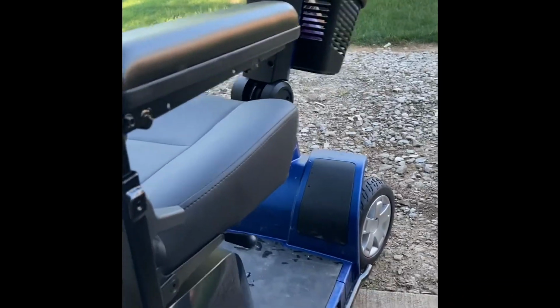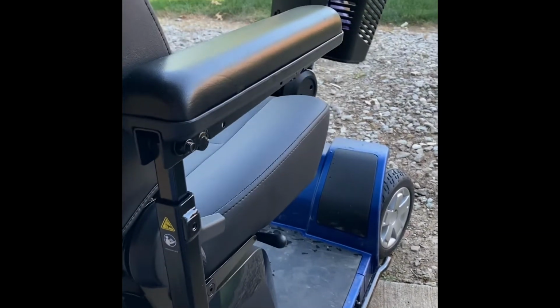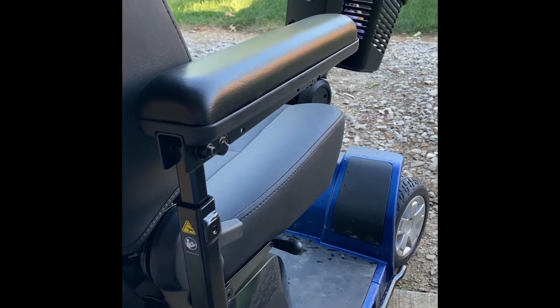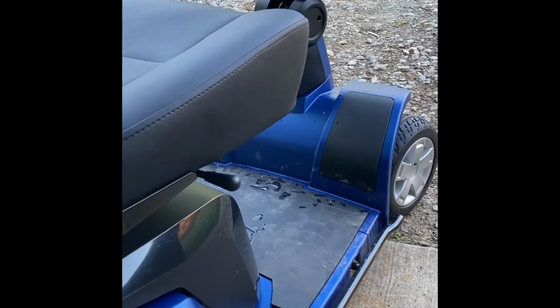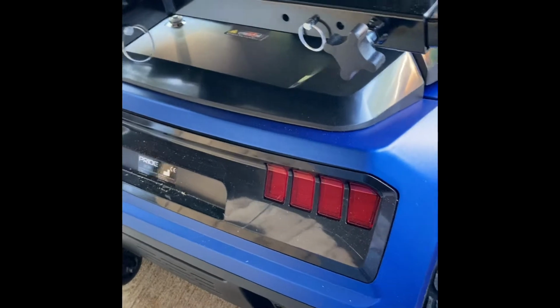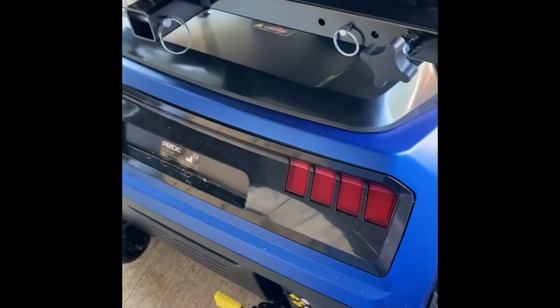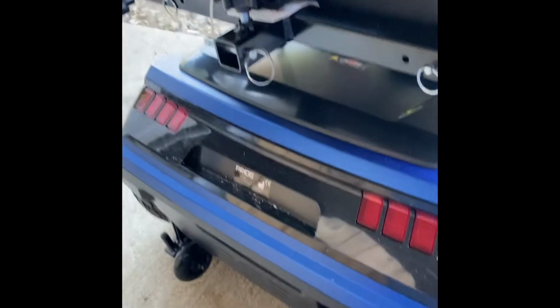Anyway, there's the scooter, Pride Mobility. It's got a lot of power. It goes well in the yard. I have to go slow in the yard because it doesn't really have much suspension in it. It's real stable. I can take that platform there and stand up on it and reach the bird feeder with no problem. I don't know why, but it's got turn signals and headlights on it. I don't plan on driving it any farther than the bird feed store. I guess I need to turn signal when I go in there.